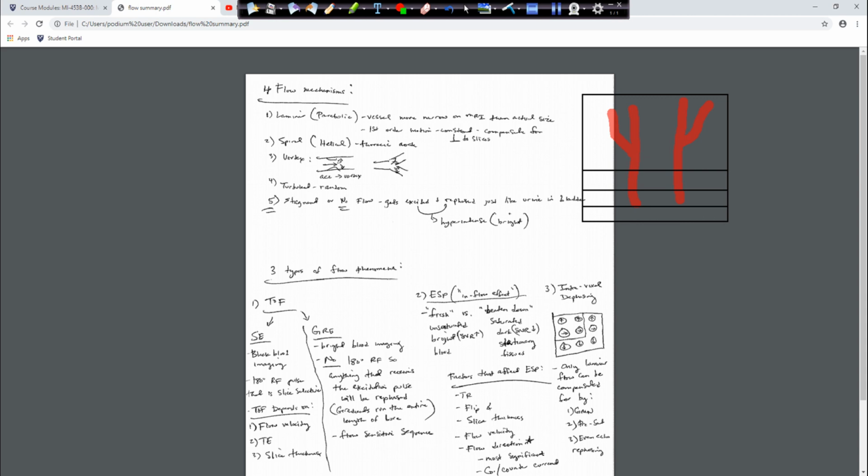We had other types of blood flow like spiral, vortex, turbulent, that we could not compensate for because it was random. We couldn't really predict that type of blood flow. So usually we get a signal void. Remember, when I talk about signal void versus no signal within the vessel, radiologists sometimes differentiate when they're dictating that. Most of the time they'll usually say signal void to mean that there's a black spot within the vessel. Okay, so it doesn't mean that there's no blood flow flowing, it's just the MRI system couldn't pick it up, so it's a signal void.